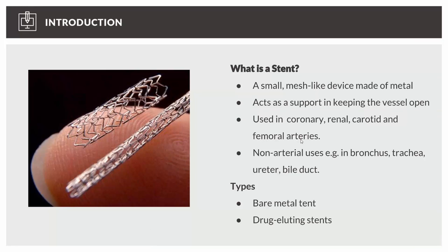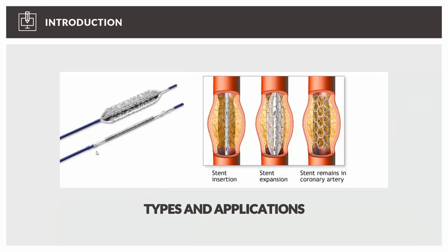So we're talking about stenosis when the vessel gets narrowed. And restenosis means that after you've applied the stent, after some time, again there will be some deposition of plaque, and this time it's in between the arms of the stent. And yes, there's also something very special about stents.